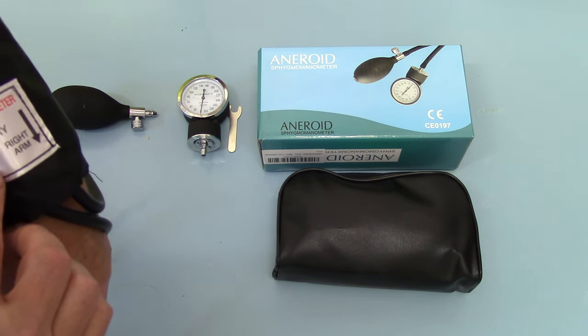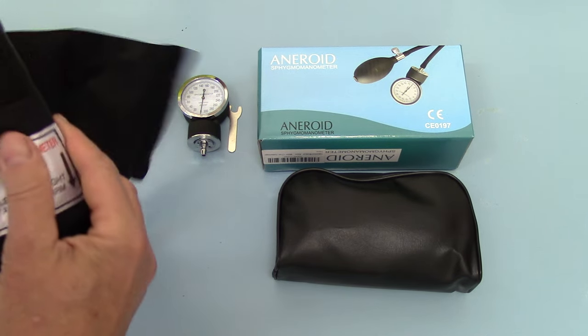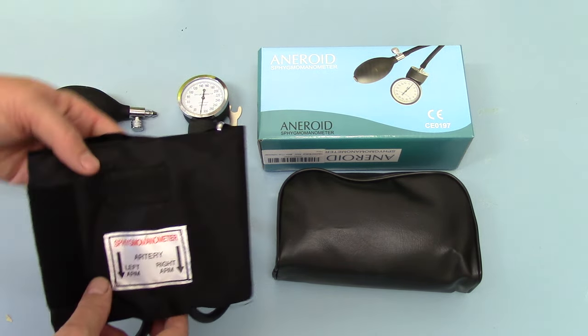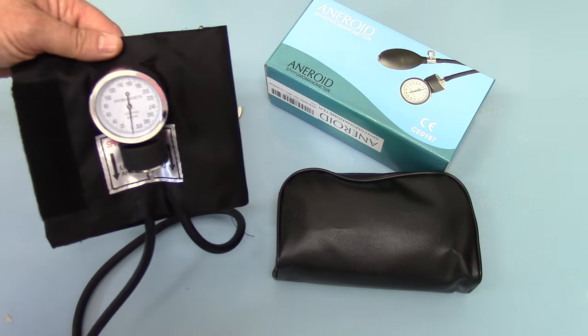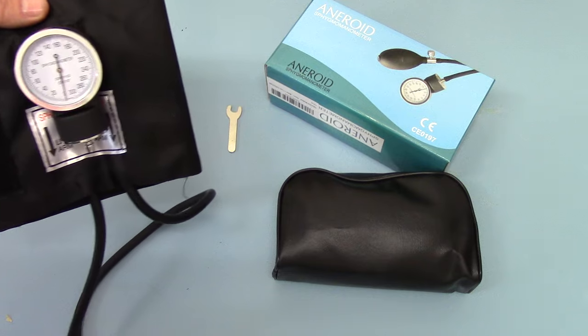There is an artery indicator on the band — it's quite difficult to show you — artery indicators, positioned over the artery for the right arm or left arm depending on which side you're using it. There is also a little retaining cuff on here which you can clip the dial to, which makes it easier to actually read when it's sitting on somebody's arm.